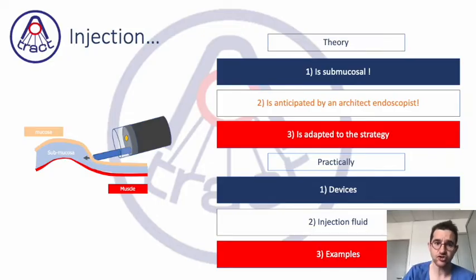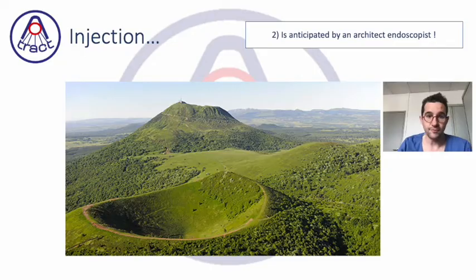Thanks to the injection you can make a difficult lesion easier, but you can also make an easy case becoming very difficult, because the injection turn it to the opposite way of your easy position.